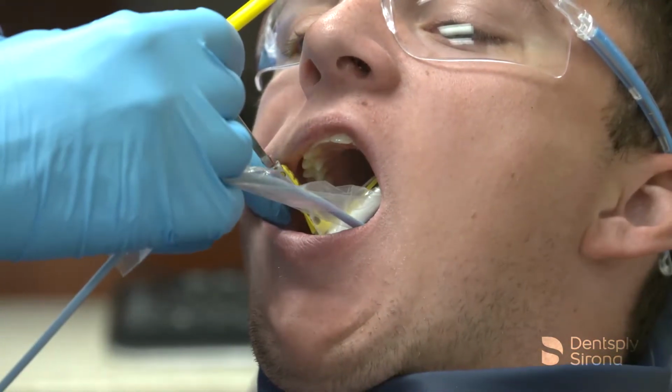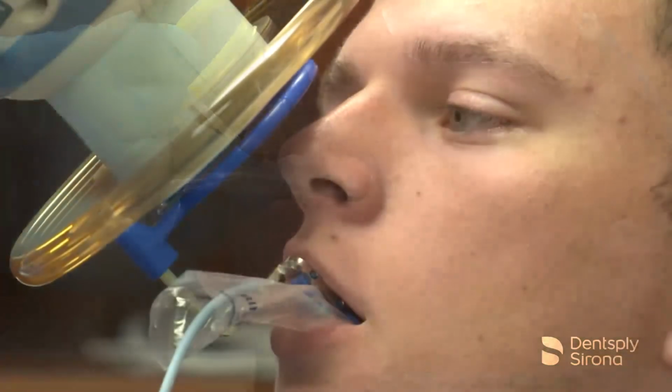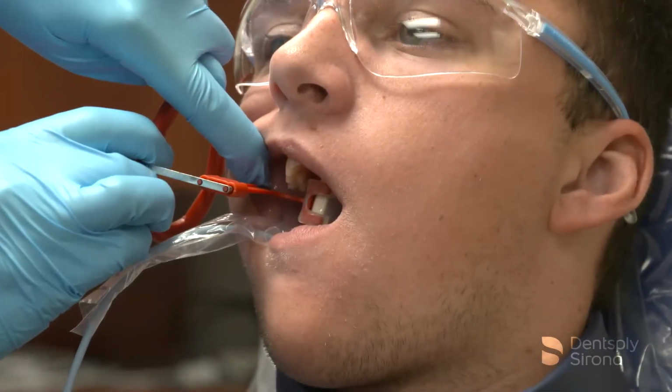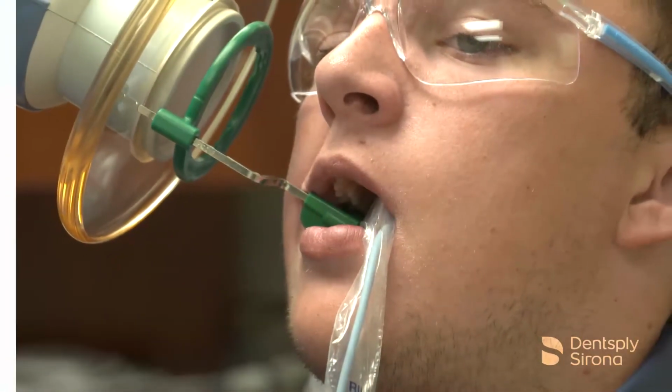Using the XCP Short Arm aiming device with a handheld portable device and following these simple image receptor placement recommendations can aid a clinician in capturing quality images.